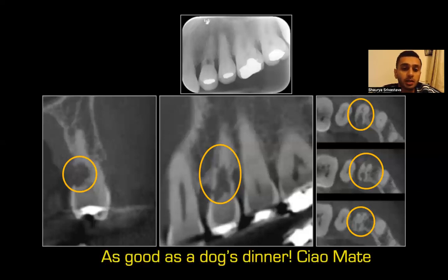So as we say, this is as good as a dog's dinner. This one's got to go. It's done its service. Okay.